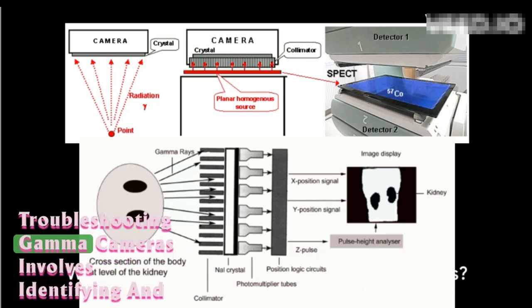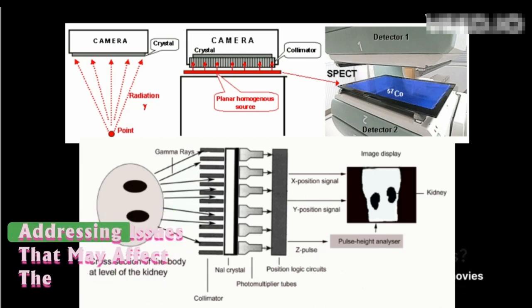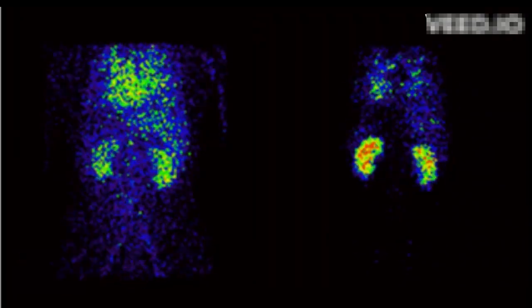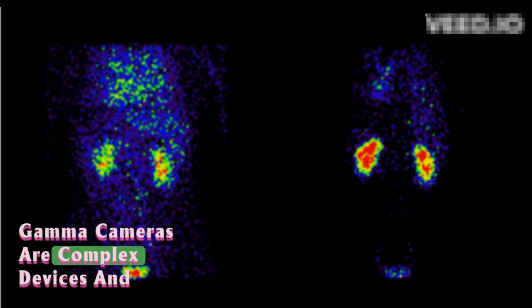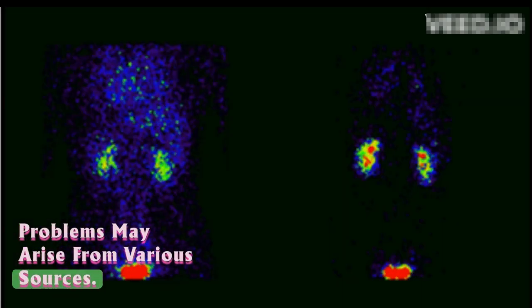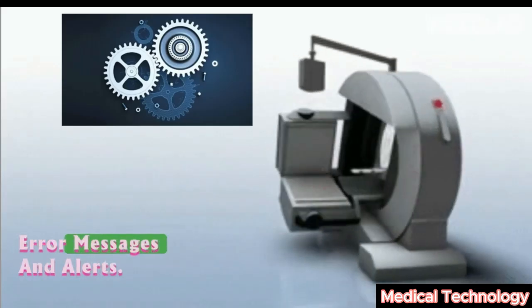Troubleshooting gamma cameras involves identifying and addressing issues that may affect the performance of the imaging system. Gamma cameras are complex devices and problems may arise from various sources. Here are common troubleshooting steps.